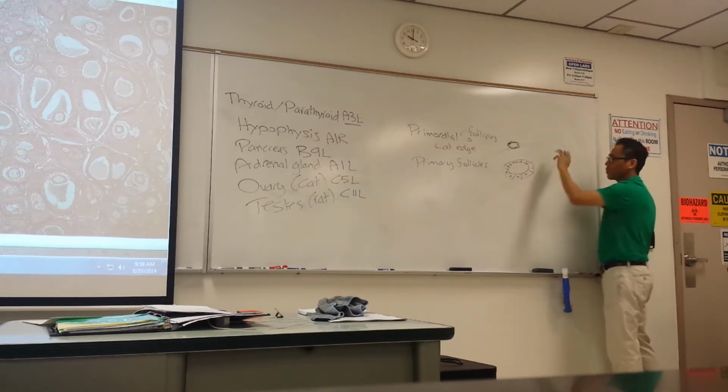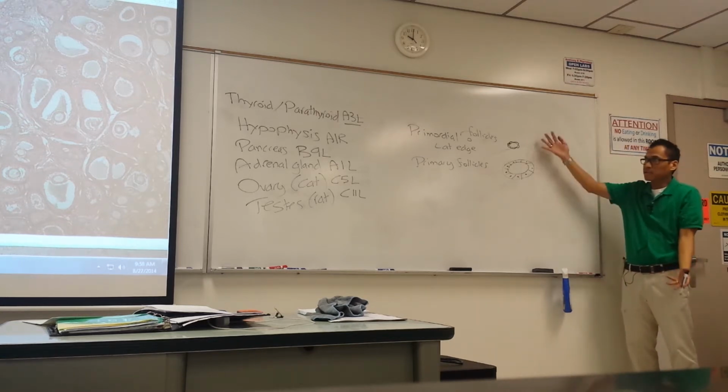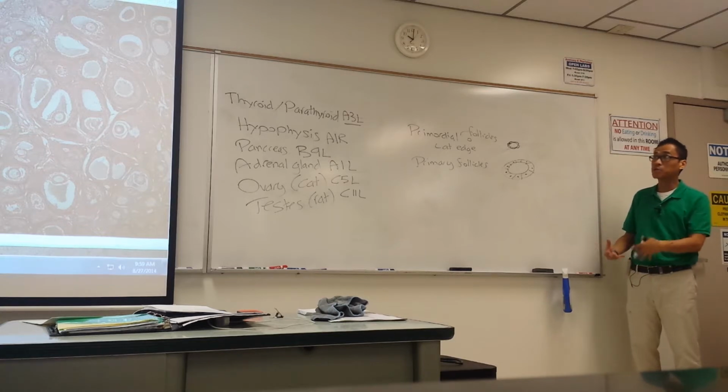But both of these follicles are not secreting anything. Okay, maybe my 8-year-old daughter has these, but they're not secreting estrogen yet. We're not at puberty yet. Okay, so these are quiescent. There's no estrogens coming from these. Yeah, it's the bigger ones.